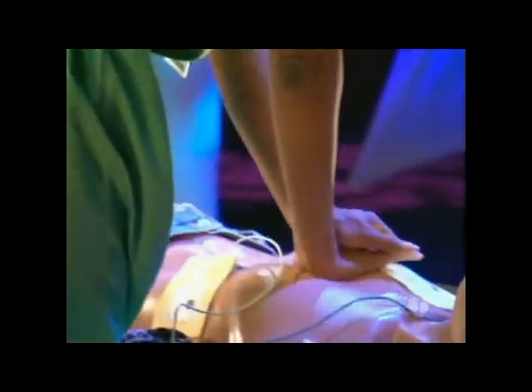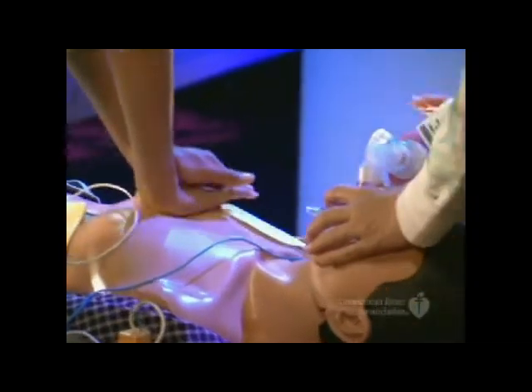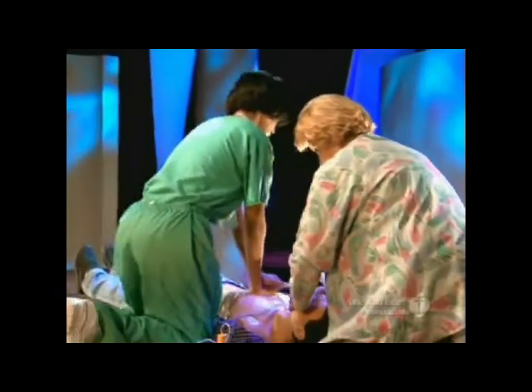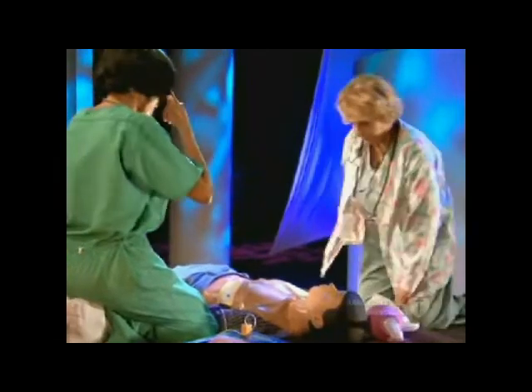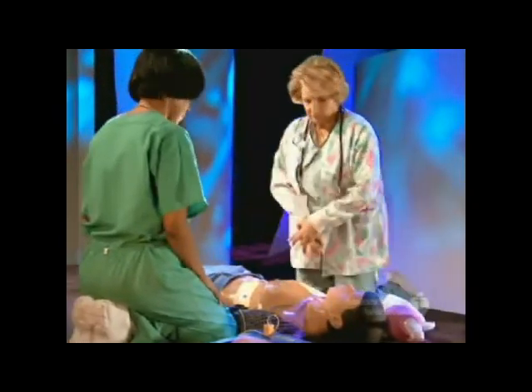The AED will then tell you to start CPR, beginning with chest compressions. Begin CPR. After 5 cycles of 30 compressions and 2 ventilations, pause for the AED to analyze. Analyzing heart rhythm. If indicated, press the shock button and switch rescuer roles.